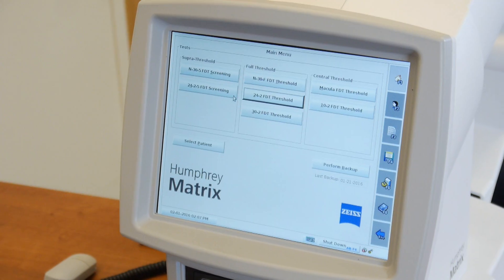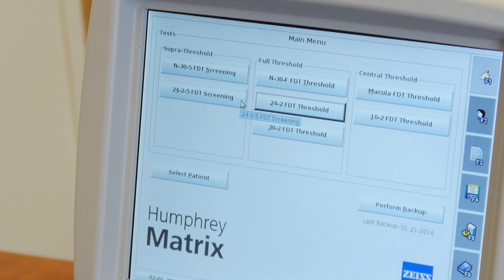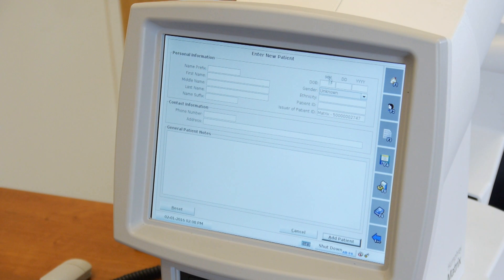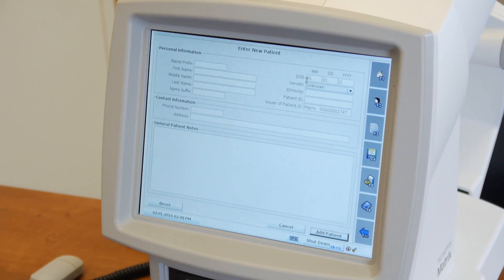On the screen, select the 24-2-5 FDT screening under the super threshold. Select add patient. Enter the date of birth using only the month and year. For the day of birth, use the first of the month and then click enter.